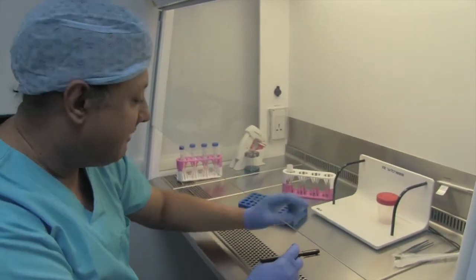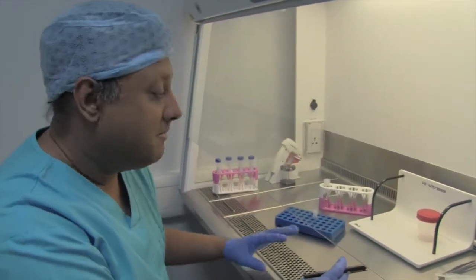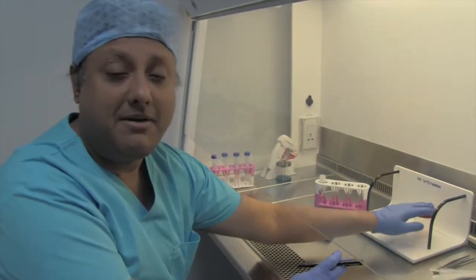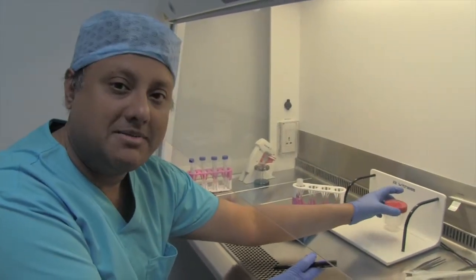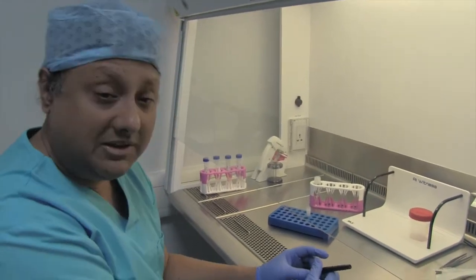On this occasion, unlike before where I said that all the tubes are labeled with the female's name — because you're trying to create a fresh process in the lab whereby you're preparing the sperm for insemination at that point — here it's a bit different because the sperm has been received and has to be frozen for the man. So all the labeling would have to be done as if it's done for the man.